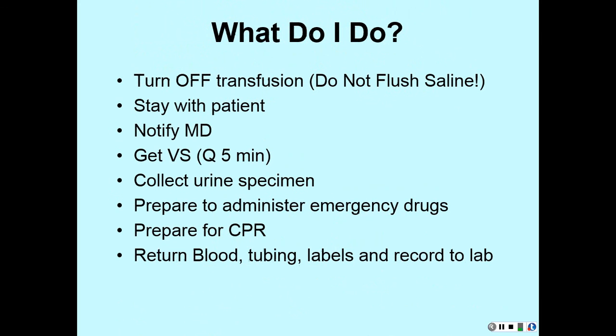You turn off the transfusion. And again, you don't want to flush through saline at this point. Like I said, you can flush your tubing and then reconnect it, or you can hang another bag of saline. You stay with the patient, have somebody contact the physician, go ahead and get your vital signs, and you need to do that every 5 minutes.